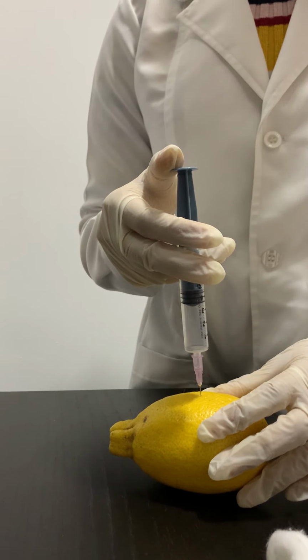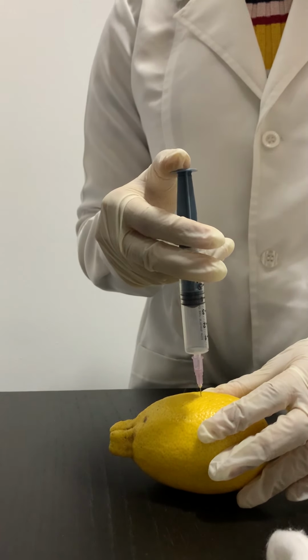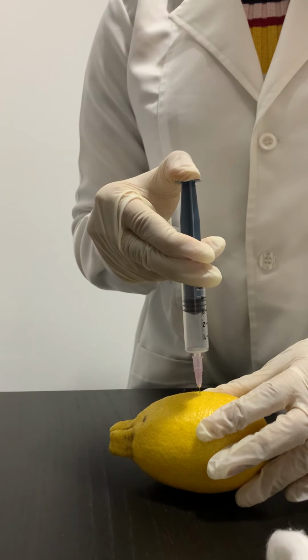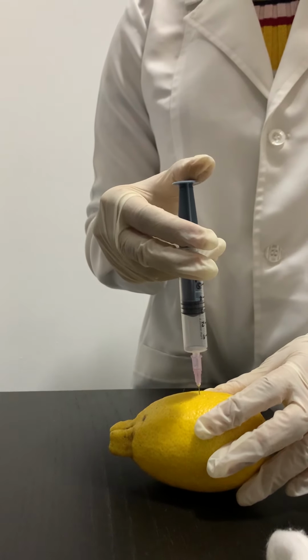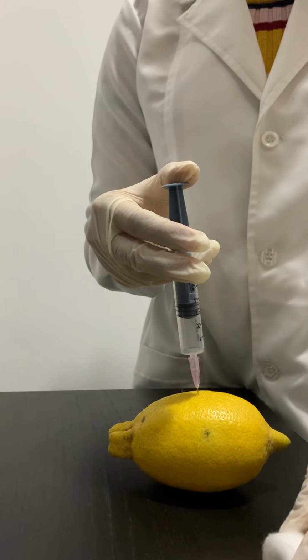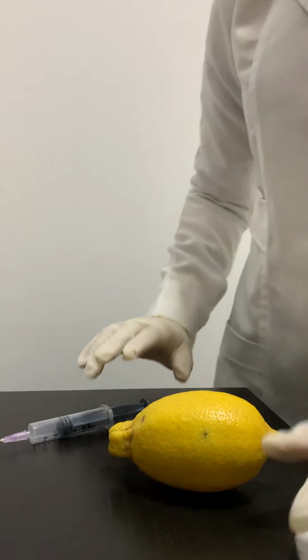Then if the blood is negative, we may advance the solution. After the solution is advanced, place the cotton and withdraw the needle.